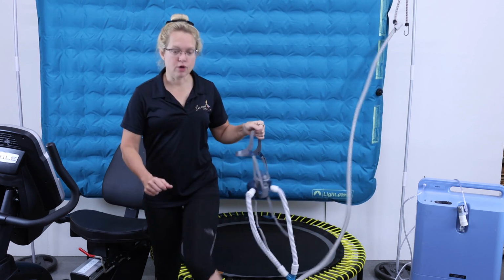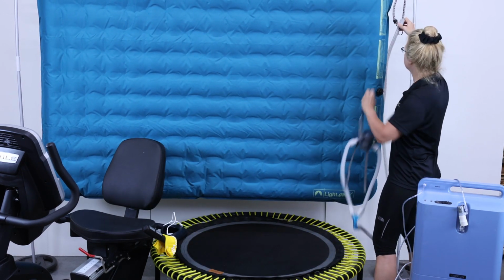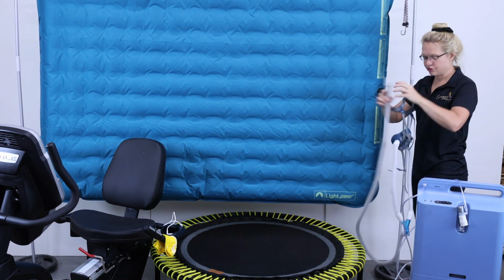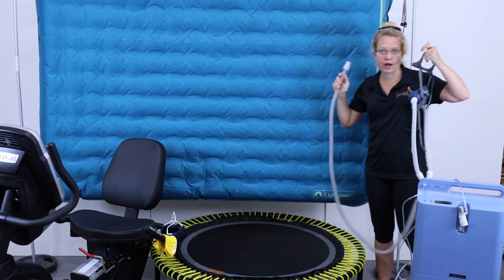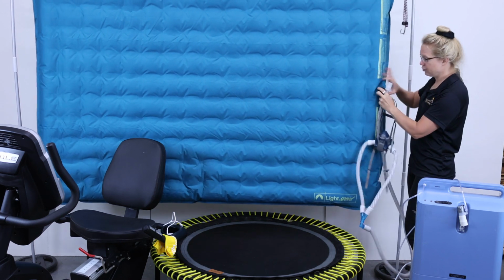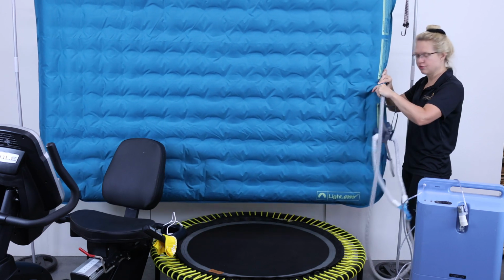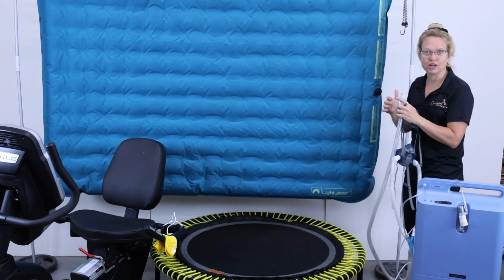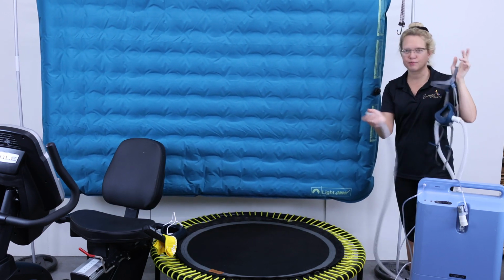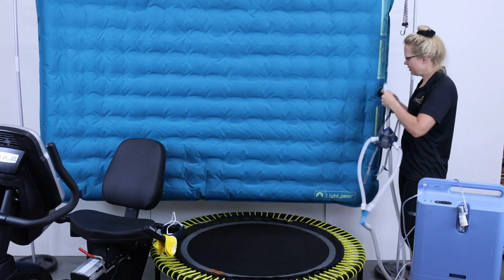So most people like to walk on a treadmill, or they like to use a recumbent bicycle. So let me show you this. Once you have your reservoir filled, you have to don your mask first so you're not fiddling around with it, okay? Then once the mask is already on your head, you come over and unscrew the cap, and then insert the hose. So you're not wasting any oxygen. If you put this in first and then you're fiddling around with your mask, all the oxygen's just coming out of your mask and you're wasting a lot of it. So always put your mask on first and then insert your hose.